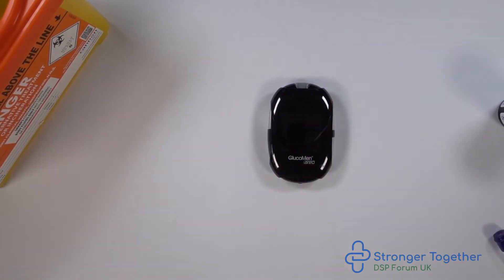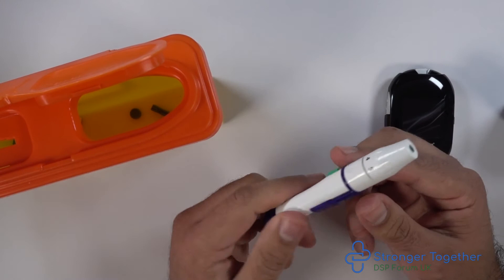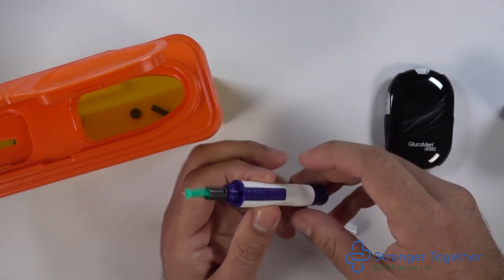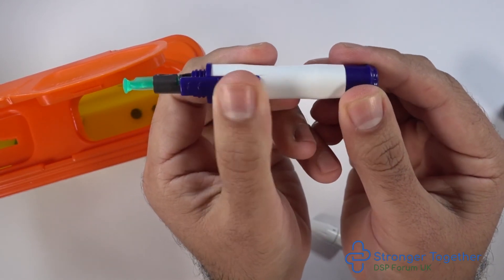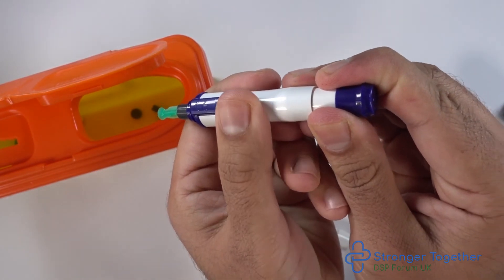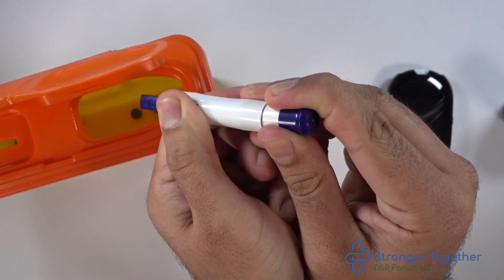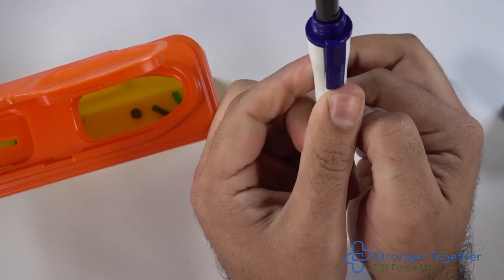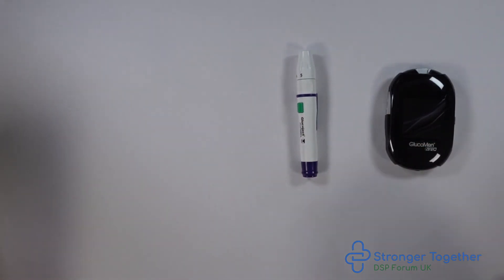Now we have finished, we can discard the test strip safely and discard the lancet from the lancing device. Unscrew the end of the device in an anti-clockwise direction — this exposes the lancet. Be careful of the needle. Push the blue slider on the side forward and pull back the plunger on the other end of the device in a simultaneous fashion, or hold back the plunger and push the blue slider forward as shown here. This will discharge the lancet into your sharps box safely. Screw the front end of the device back on in a clockwise direction and store your items in the wallet which came with the device.